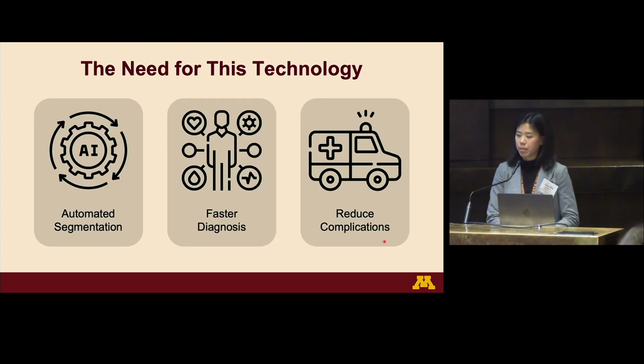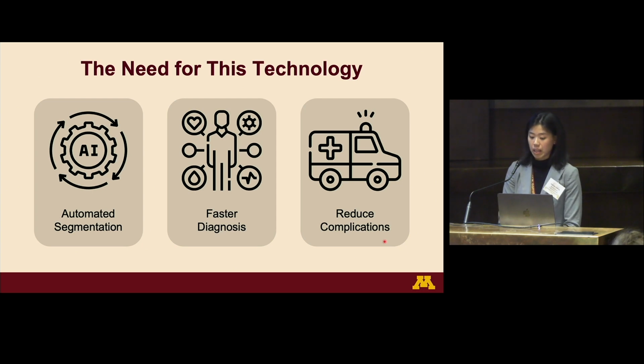So why do we want to develop a tool to automatically segment chronic subdural hematoma? Let me tell you a true story about a patient case that my PI was asked to be an expert witness of. A patient went to an outpatient radiology facility and had a CT scan done on a Friday night, but the CT scan wasn't read by the radiologist until Monday morning. During the weekend, he deteriorated and got worse at home, ending up almost dying. He then went to the emergency department and had a neurological procedure done very quickly. He survived it. This incident happened because no one read the scan immediately.